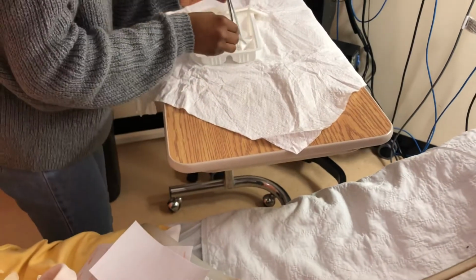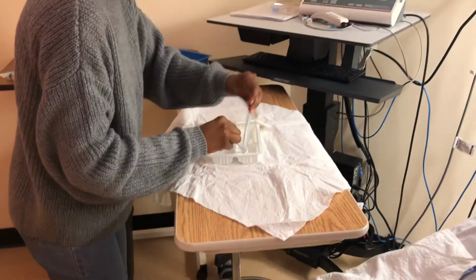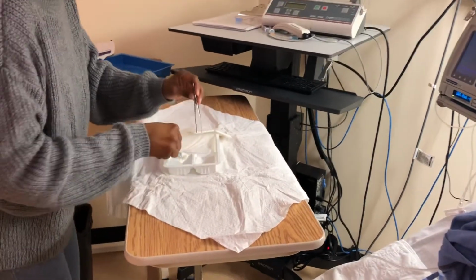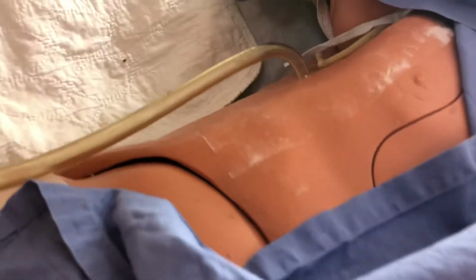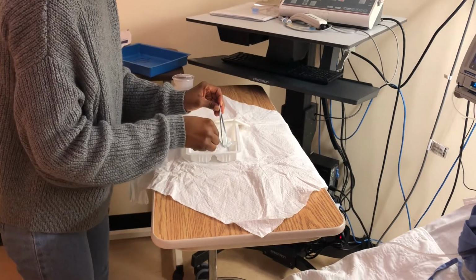The dirtiest, the most inner to outer. Bigger area, one swipe and it's dirty. So just one full swipe here. Dispose of the garbage.